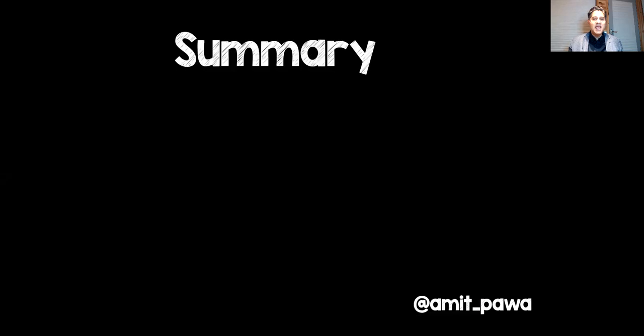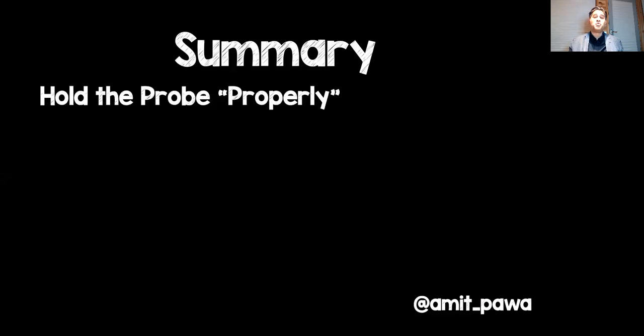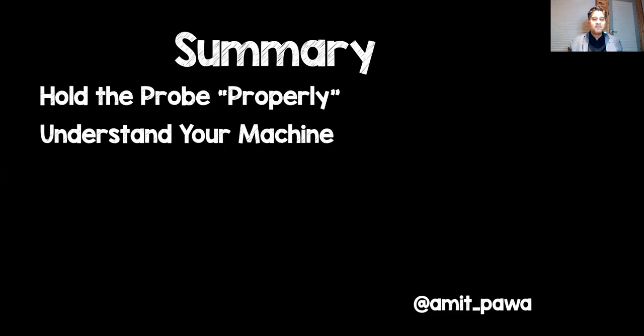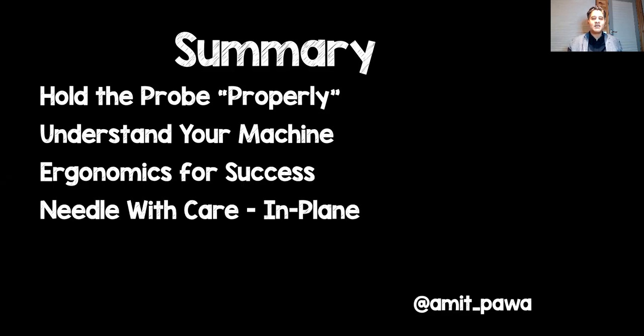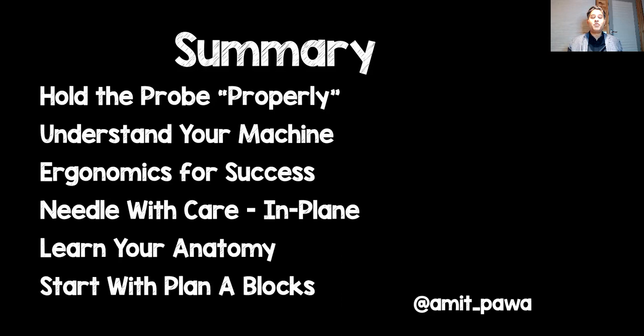So that brings us to the end. Let me summarize. Make sure you hold your ultrasound probe properly. Understand how to use the machine. Learn how to turn it on. Use the right preset. Use the correct frequency and gain and depth. Think about ergonomics for success. Take care when you needle. Try to needle along your visual axis and needle in plane. Learn your anatomy. And when you're doing your blocks in real time, start off with Plan A blocks and use those resources that are out there.